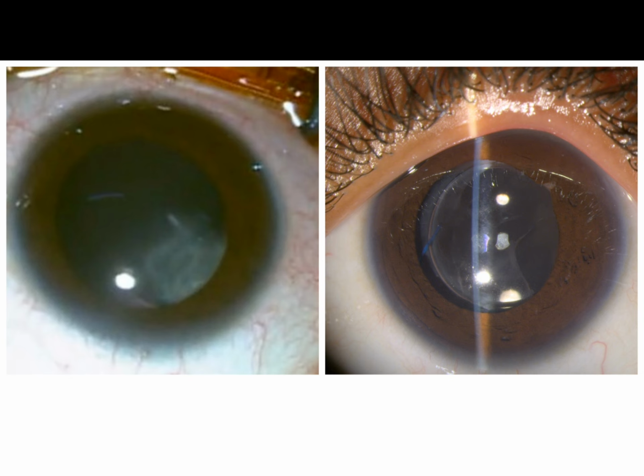In conclusion, cysts arising from iris invading lens causing cataract is rare, and those extending to visual axis can be amblyogenic, requiring surgery. This case had a good visual surgical outcome.